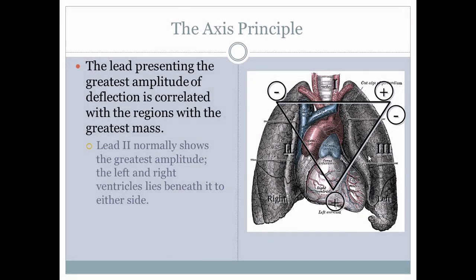The axis principle. This is something that, as a monitor tech, I very, very rarely, if ever, looked at. However, we did cover some attributes of this, and I did my own personal research as well, and based on the lecture that we had yesterday, I was able to formulate kind of an overview of what I feel are the important points in how to understand what axis means.